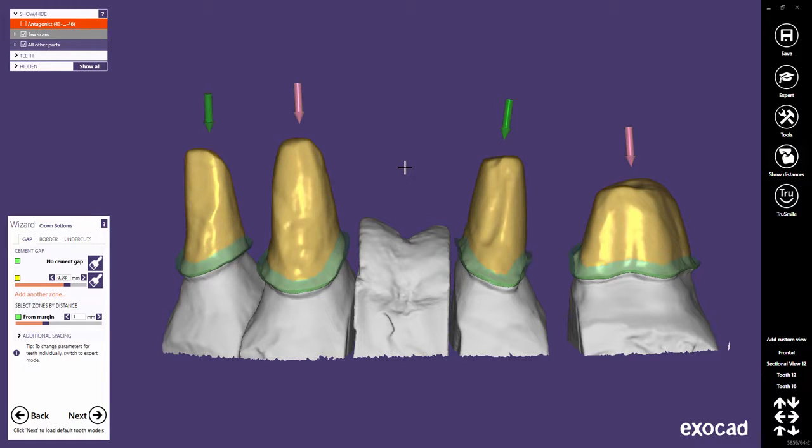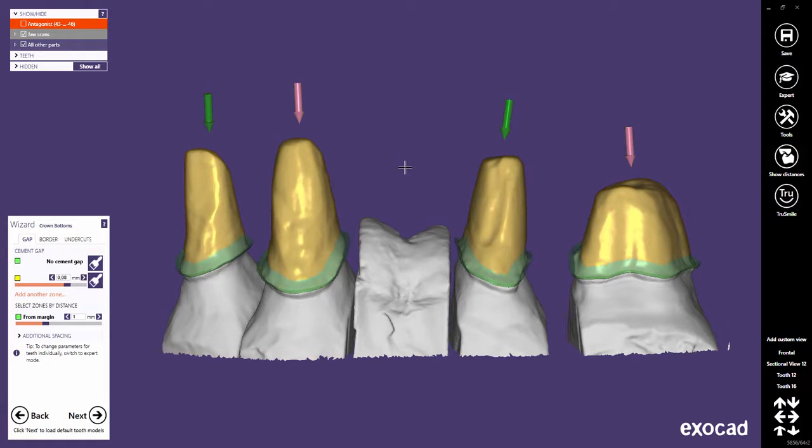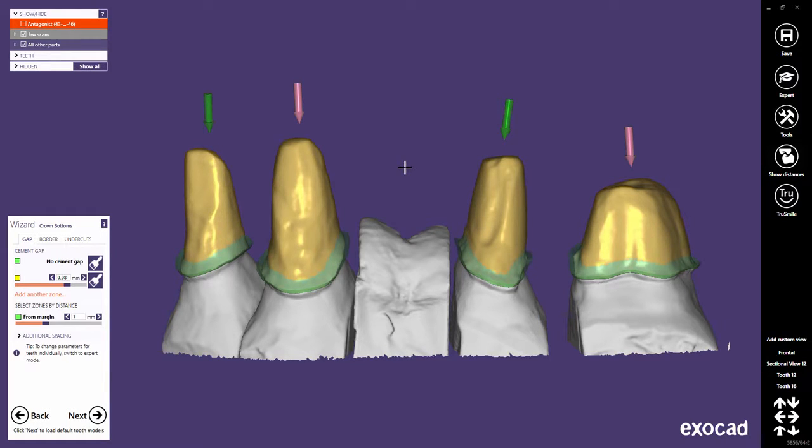In the 5-axis mode, you will notice that the arrows show individual insertion axes for each tooth, whereas the 3-axis mode enforces a unique insertion axis for bridges. Note that you will not always be prompted to define the insertion axis.